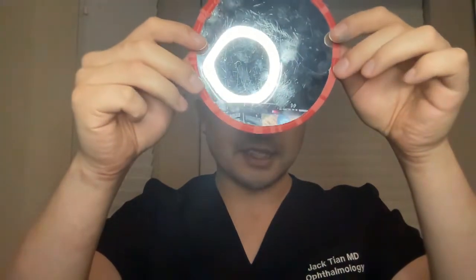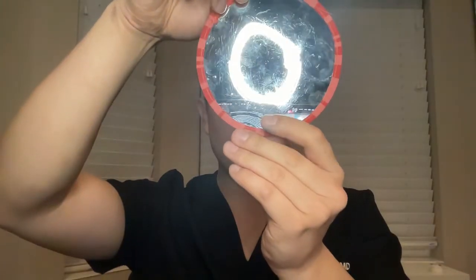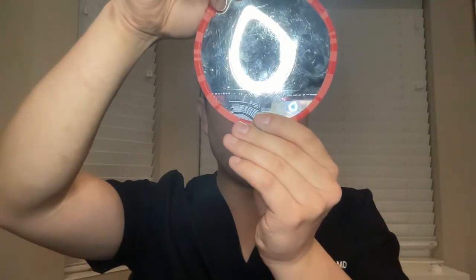I would like to demonstrate once again the effect of astigmatism and the distortion to an image using this mirror. I ask you again to focus on the ring of light. And if I were to put slight pressure on one axis of this mirror, it will distort that ring and make it oval. And if I were to do it in another axis, it will distort that round shape to an oval shape.